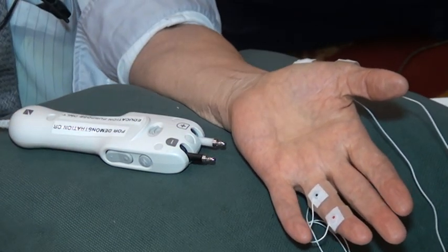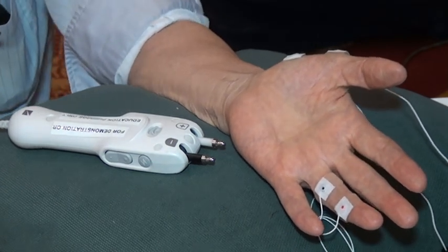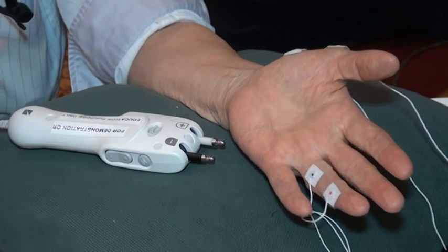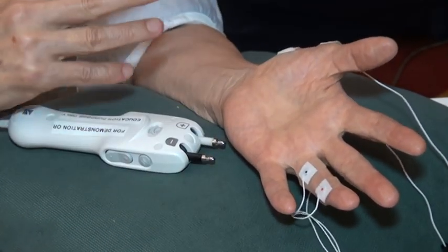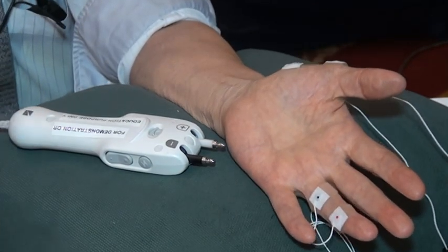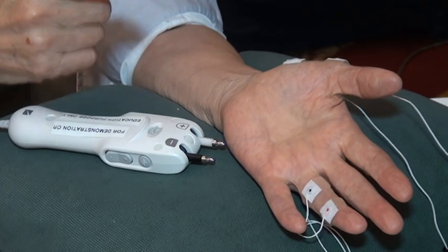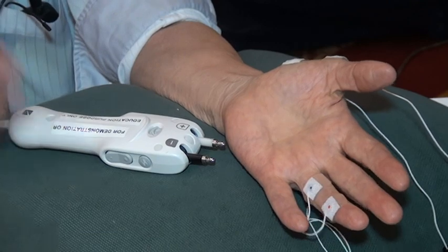So the thing you have to remember is that the recording electrode is very non-specific. It records anything because the hand is a volume conductor. Whatever happens in the hand, it records. So looking at the waveform, you don't know where it's coming from. That's why you have to look for the muscle twitch. That's the theory. So that's the main thing.